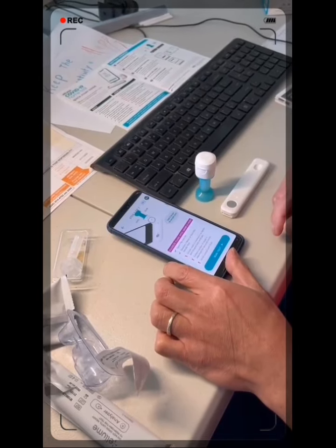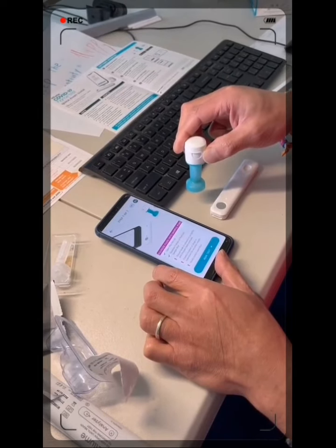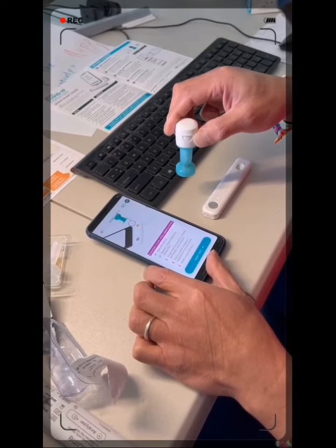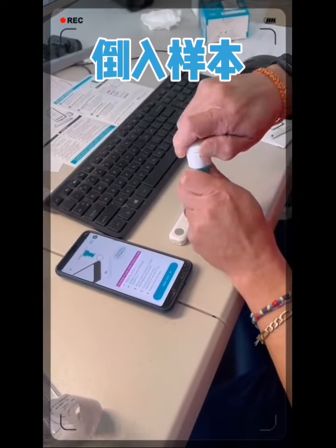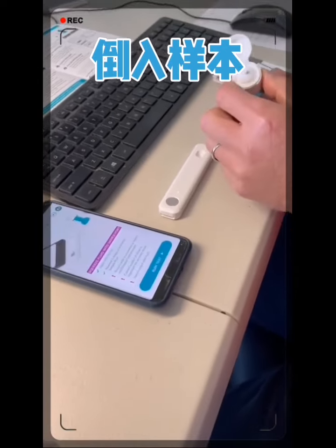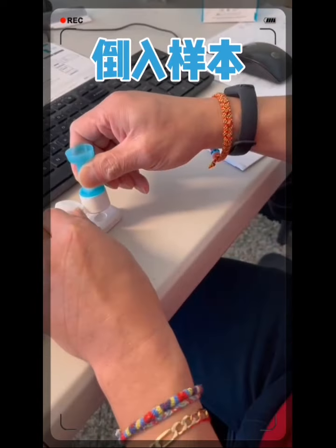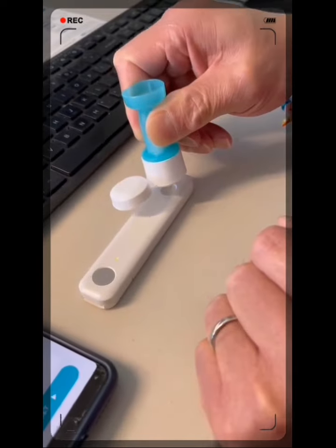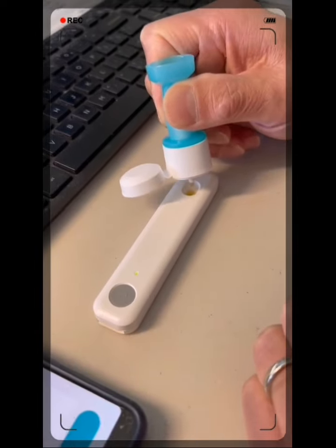Open — flip top. Squeeze five drops vertically. There's one, two, three, four, five drops.